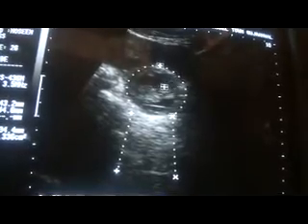Let's study the cyst in lateral magnification. Now I am going to magnify the cyst so we can study it in detail. So this cyst, now here after magnifying, what we see is that this cyst contains a fluid compartment in its posterior region. This is the fluid compartment — from here to here, this black area is the fluid component.